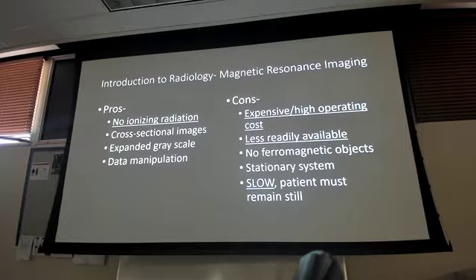But if you can walk into the room, and if I have this on me and the scan is not going on, it's not going to affect the scanner necessarily. Because you've got to think the patient's beds have metal on them and things along those lines. So it's constantly going, but it's more like a fridge magnet level when you're loading stuff. But once the patient is on there and they kick the machine on, that's when the high power magnets hit.